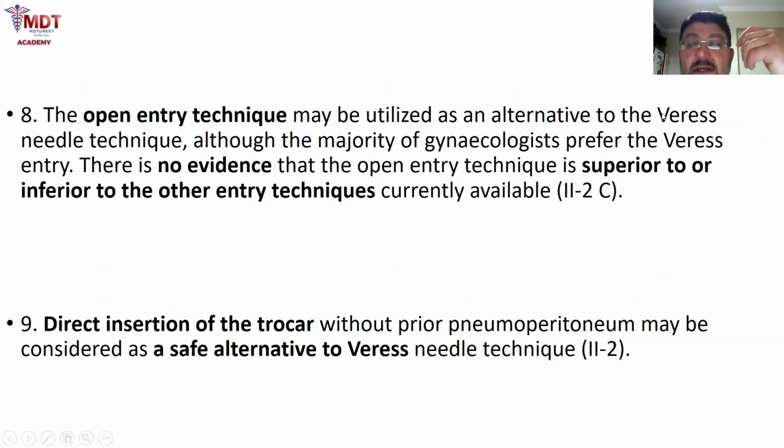They recommend the open entry technique, which is an alternative to the Veress technique, but they also recommend that there is no evidence that open entry technique is superior or inferior to the other techniques. As I told in the first session, I am doing open laparoscopy, and I believe in open laparoscopy because all of the other techniques are blind techniques.